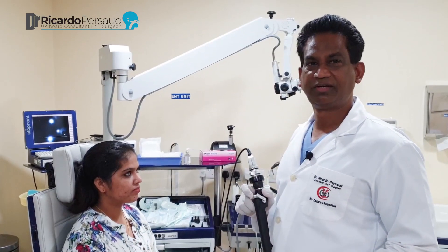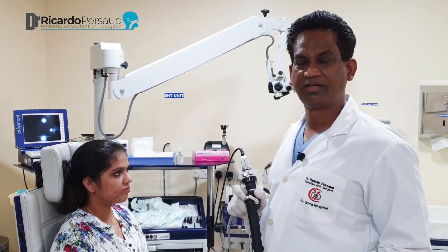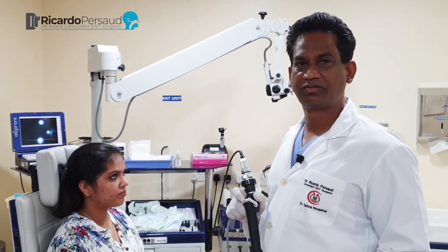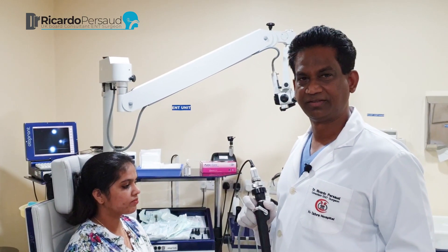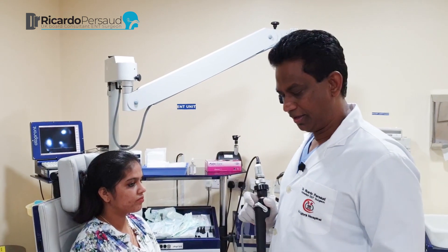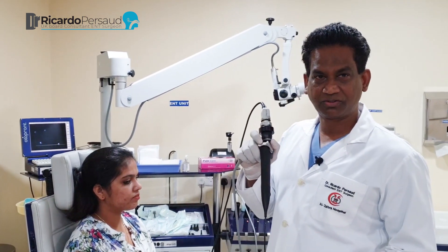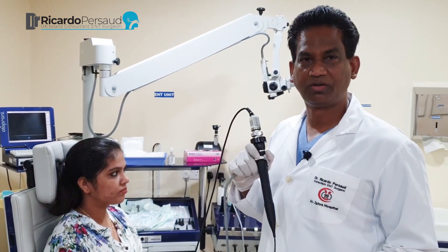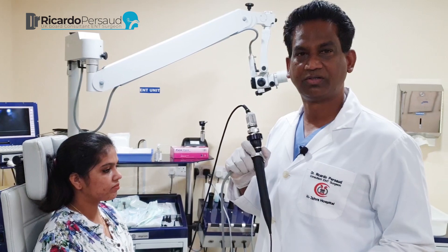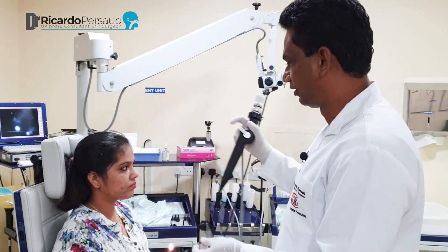First, I'm going to demonstrate the anatomy in the nose that's relevant to COVID testing. This is a flexible nasal endoscope and I'll be able to show you all the anatomy on the screen, which is just over there.